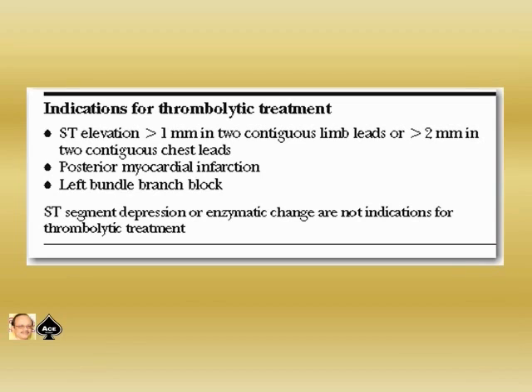So the indications for thrombolytic treatment are ST elevation more than 1 millimeter in contiguous limb leads or more than 2 millimeters in contiguous chest leads, posterior myocardial infarction, then left bundle branch block. ST segment depression or enzymatic changes are not indications for thrombolytic treatment.